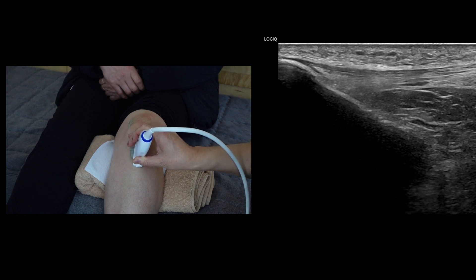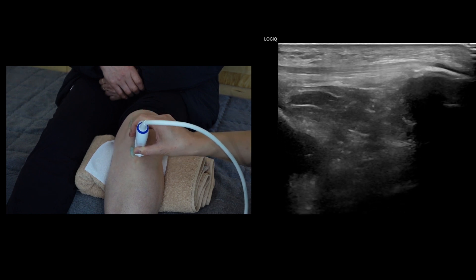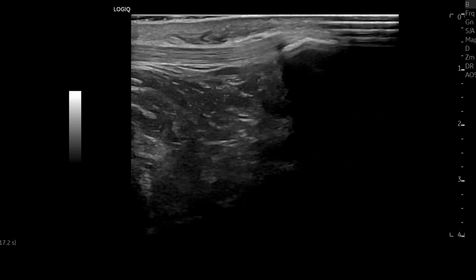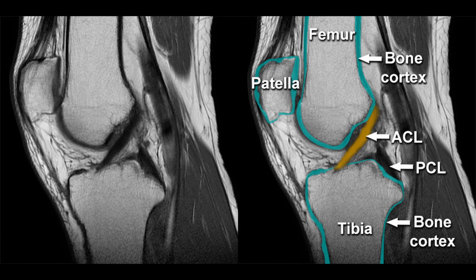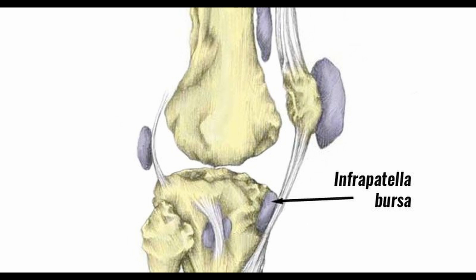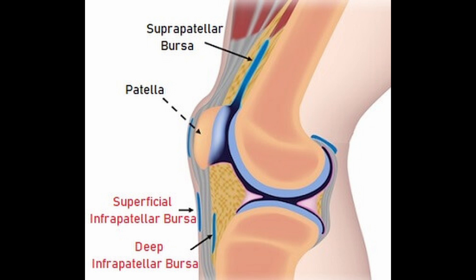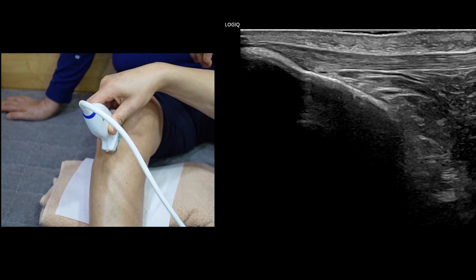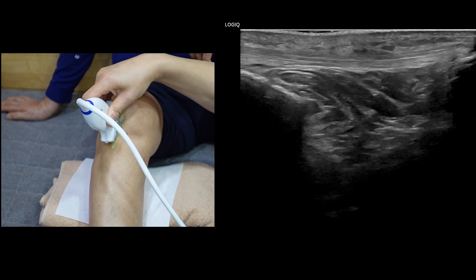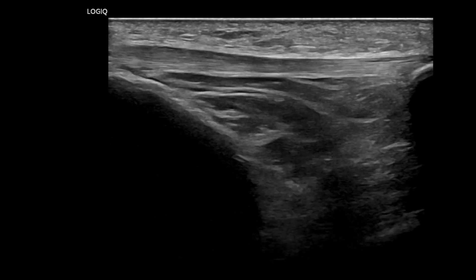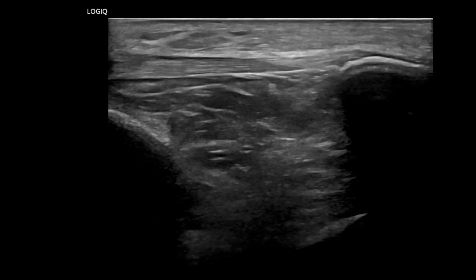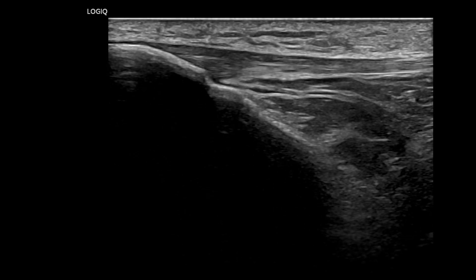I look for pathological deterioration of this triangular-shaped fat pad. On the surface of the tibia, the anterior cruciate ligament is located approximately posterior 1.5 centimeters from the anterior margin of the tibia. Check the deep infrapatellar bursa between the distal patellar tendon and the anterior aspect of the tibial epiphysis. Mild distension of this bursa, appearing as a small triangular hypoechoic area, is usually considered normal. Although I routinely inspect the infrapatellar bursa, I rarely find clinically significant infrapatellar bursitis.